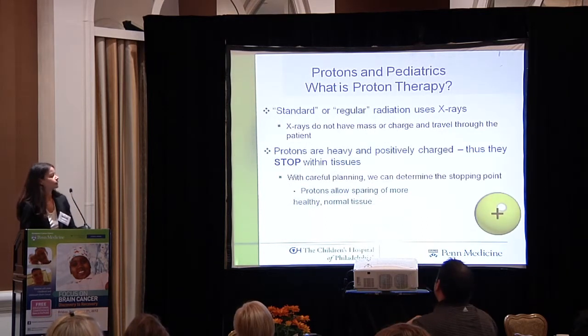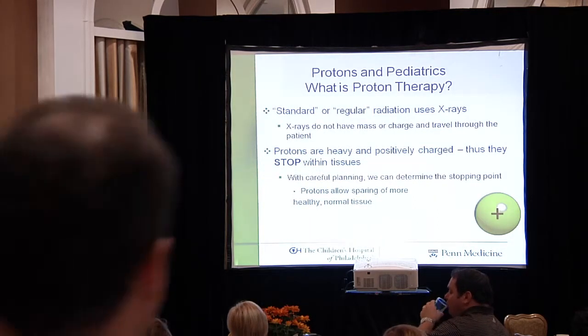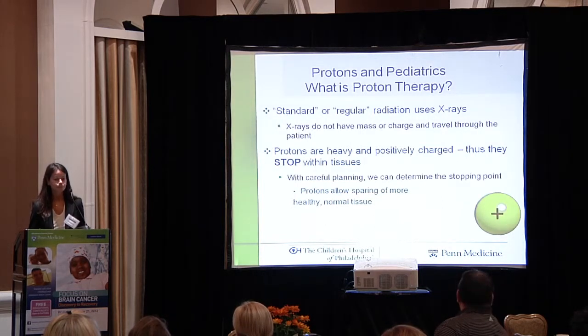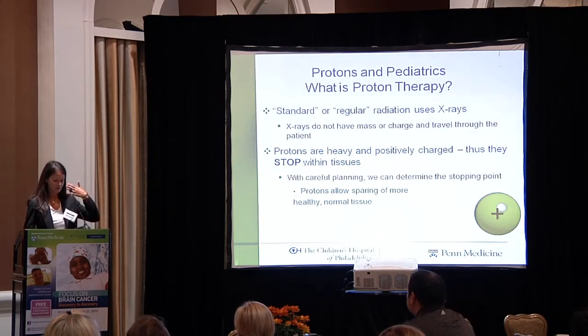So what is proton therapy? Well, let's start talking first of all about what people mean when they say regular radiation or standard radiation. What they usually mean is radiation that's delivered using very high energy X-rays. X-ray therapy uses the same type of X-rays that you use to get a chest X-ray, except they're about 1,000 times the energy. When you think about getting a chest X-ray, generally the X-ray machine is in front of the patient. The patient stands right here, and then there's a piece of film behind them.